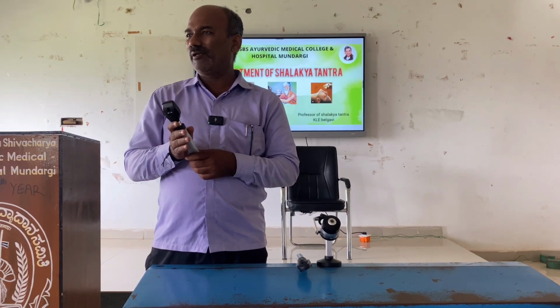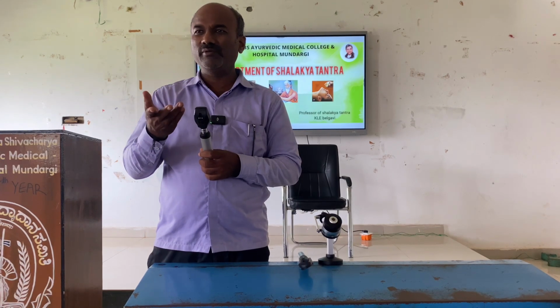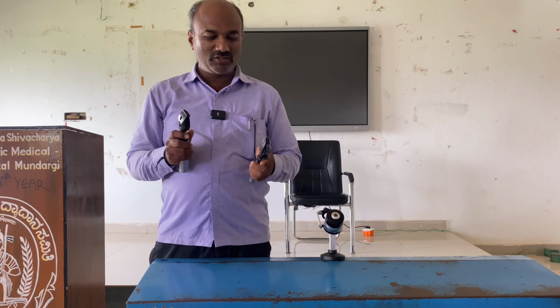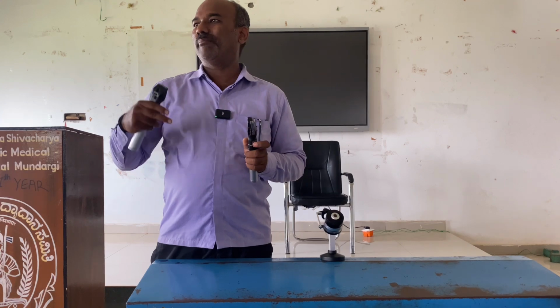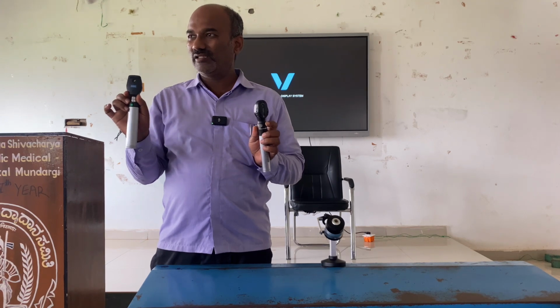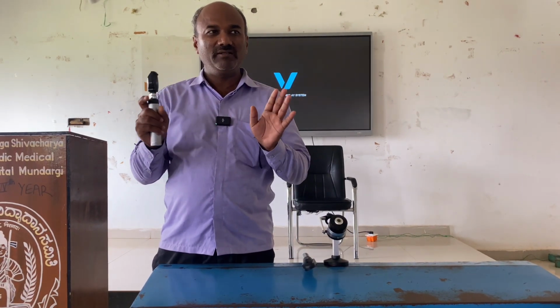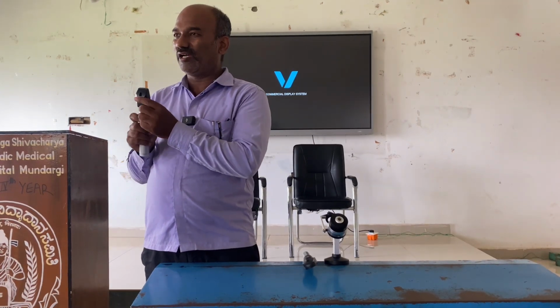Your mobile battery might be 4000 mAh, yours may be 5000. Similarly, some companies skip some of the powers and prepare the tray. Some companies give you the provision of one extra notch, so that a maximum number of lenses can be given. Based on the model, the price and the number of lenses vary. But the remaining features, like the filters, are the same in all the instruments. Next, on the anterior surface, we have two structures.